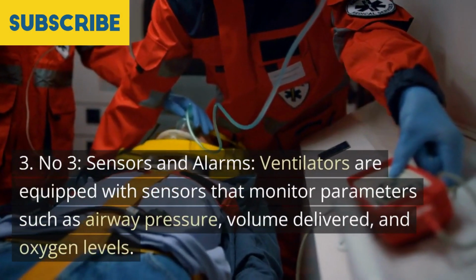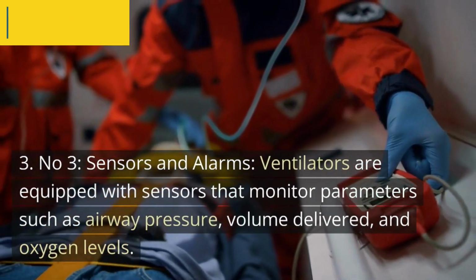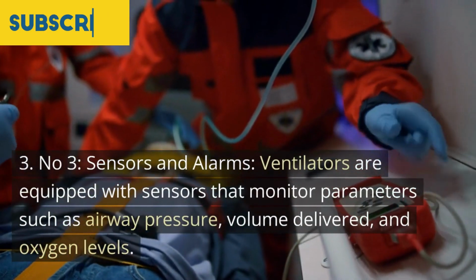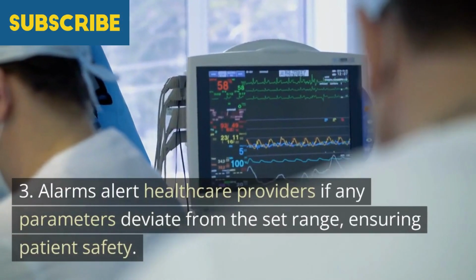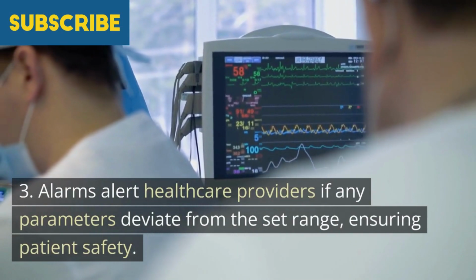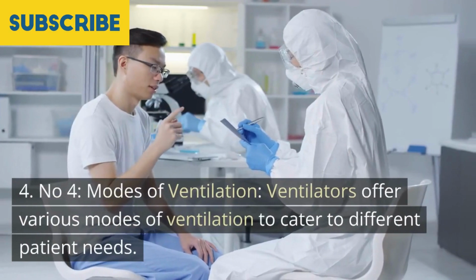Number 3. Sensors and alarms. Ventilators are equipped with sensors that monitor parameters such as airway pressure, volume delivered, and oxygen levels. Alarms alert healthcare providers if any parameters deviate from the set range, ensuring patient safety. Number 4.